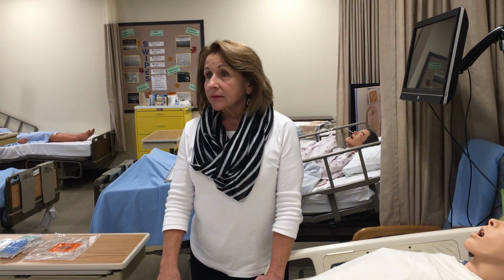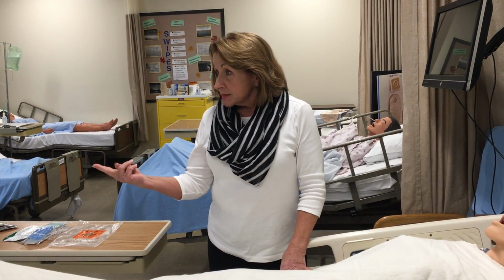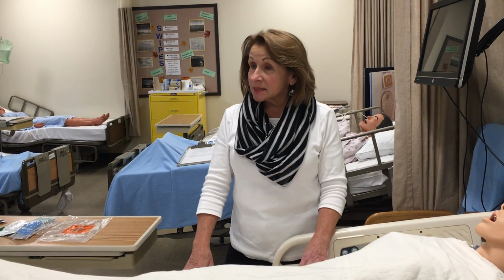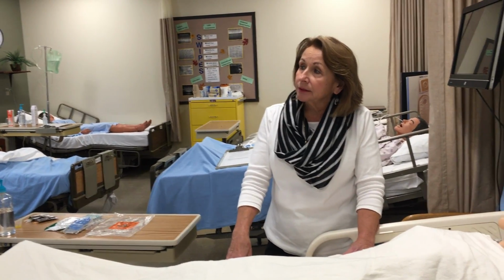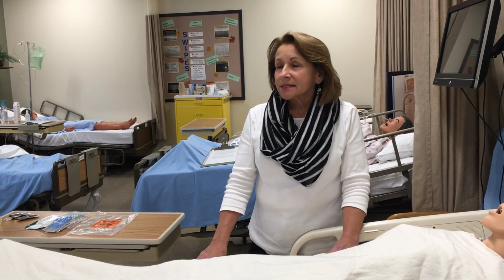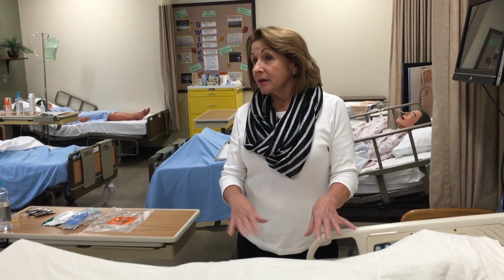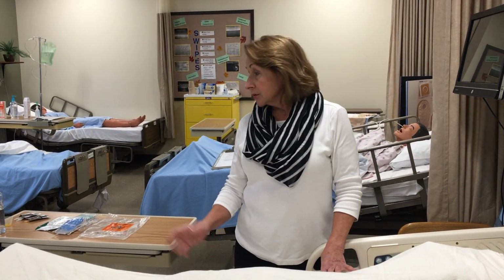But before we cath, you always want to provide hygiene care for two reasons. Why are we going to do perineal care before we do the actual catheterization? Prevent infection. Okay, we're going to try and get rid of as many bugs as possible. What's the other reason it's helpful to do care? Visually start to see where you're going. Yeah, it's a sneak preview. You want to be able to see if you can locate the urinary meatus. It's better to do it now while you're not sterile than later on. So it helps you do a pretty thorough assessment so you know what you're doing when you get all gloved up.